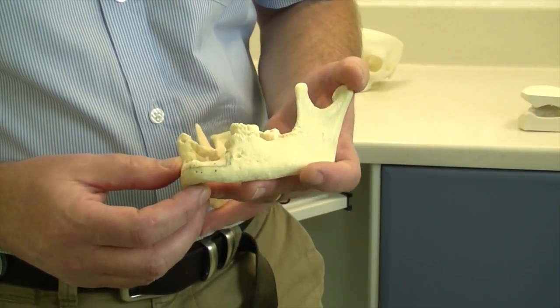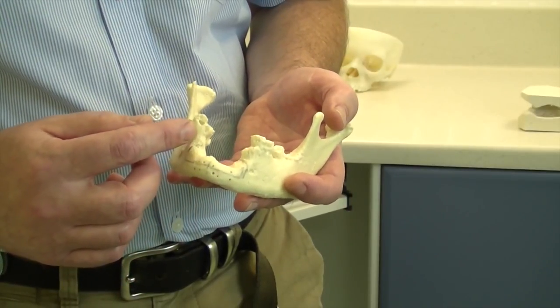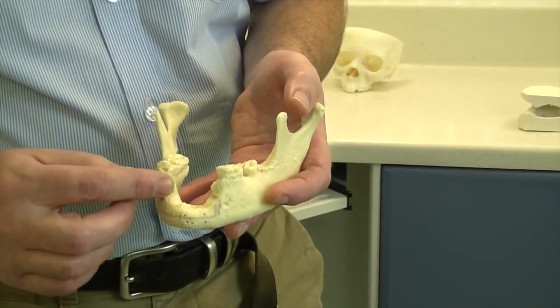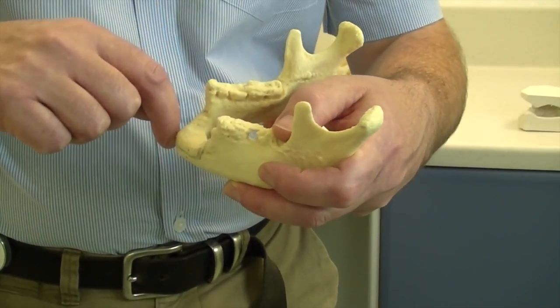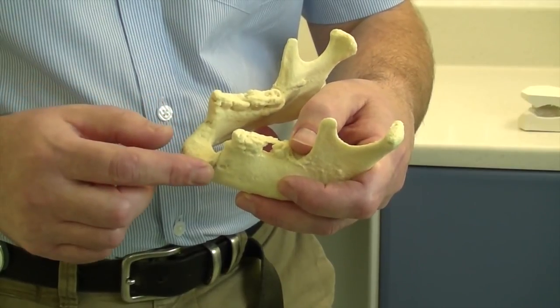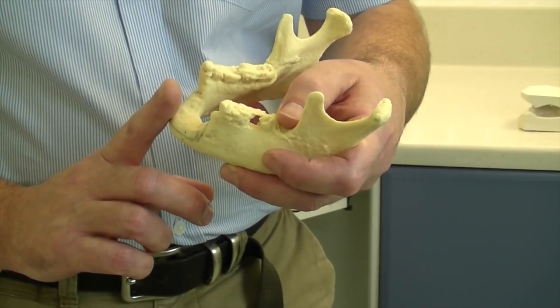Having the model printed allowed us to plan the jaw surgery, which in this case was a procedure called distraction osteogenesis, which involves making some cuts and then expanding the bone up in height, but using a vector which makes sure that the bone grows up in the right dimensions as opposed to in this orientation or in this orientation. And that allowed us to plan the surgery, but also then have the distraction plates constructed to give us a correct vector for growth. So this is one of the areas that having a 3D model has revolutionized our surgery.